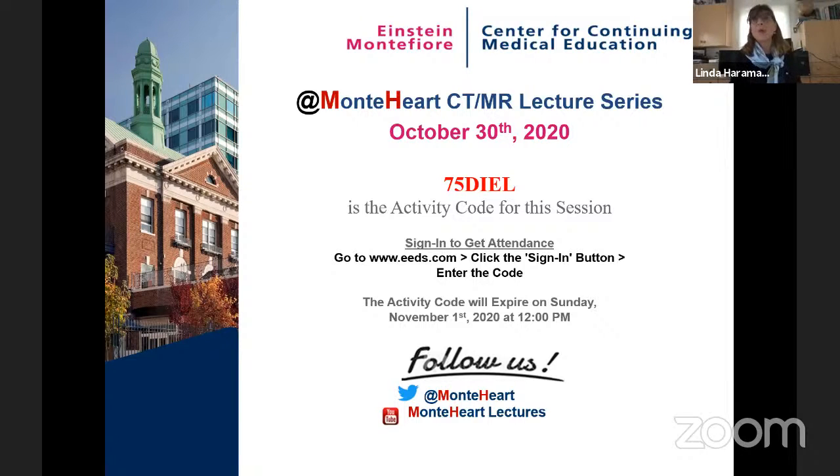so that we do a timing bolus, and we try to pick a time that has good opacification but differential opacification of the right and the left heart, so that when we do volumetrics of the ventricles, if both ventricles are exactly the same amount of enhancement, it's technically almost impossible to, for example, measure the stroke volumes and the function for both ventricles, we need to have differential opacification.